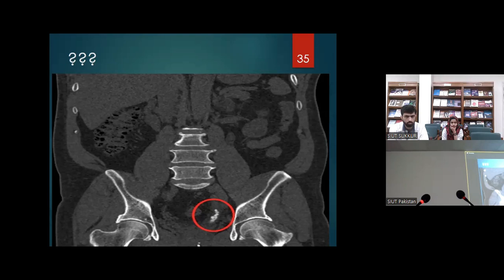Now comes the importance of this infundibulopelvic angle. If you are selecting a stone for lithotripsy and the infundibulopelvic angle is less than 45, the stone will break, but it will not come up and come down. First, it has to jump up and then down. So for these kinds of stones, the standard operating procedure now is to select some kind of PNL. It is not ESWL nowadays. So you see the energy source and the technology are there, but the indication is now changing. The indication is changing, and some of the physics and geometry have to be taken into consideration. It is not the impression of a single person that it will or will not come out. It has to be something written down, some kind of formula, some kind of mathematical notation. This is what normality is these days.